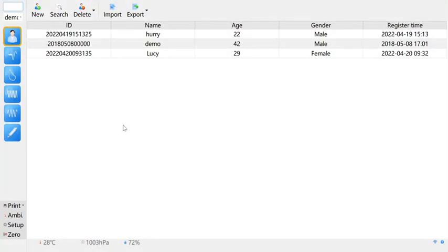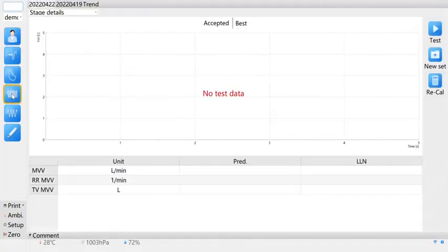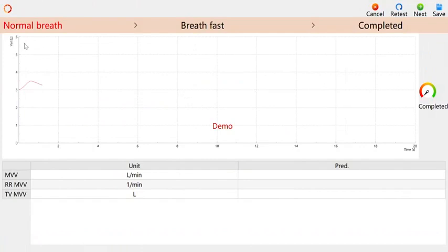Click the fourth icon on the left to start the MVV test, and click Start Measurement. MVV is divided into 2 steps, normal breathing and rapid breathing. Click the test to take 4 to 5 normal breaths and enter into rapid breathing.